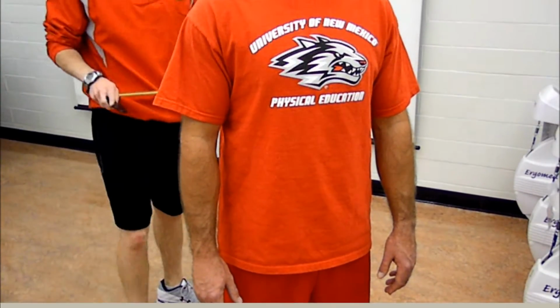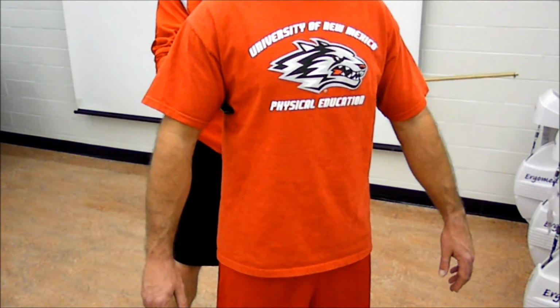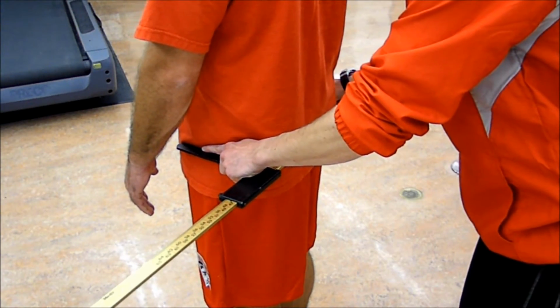To properly assess skeletal diameter, the technician should hold the skeletal anthropometer or sliding caliper with both hands with the fingers placed along the tips of the instrument. The caliper should be placed on the body landmark to be measured. Firm pressure should be applied to adequately compress the underlying fat, muscle, and skin. Pressure should be applied until the measurement no longer decreases.